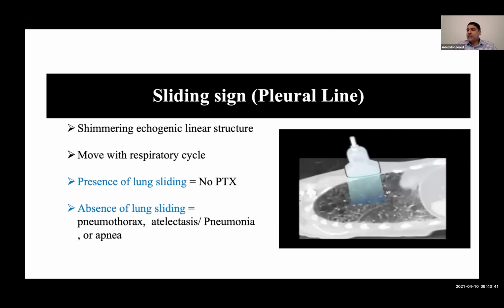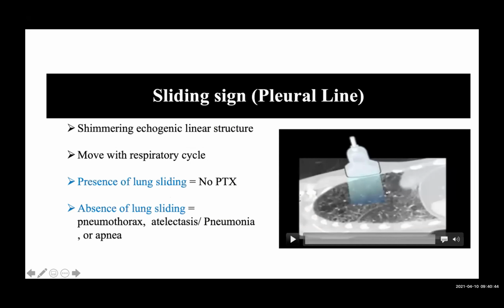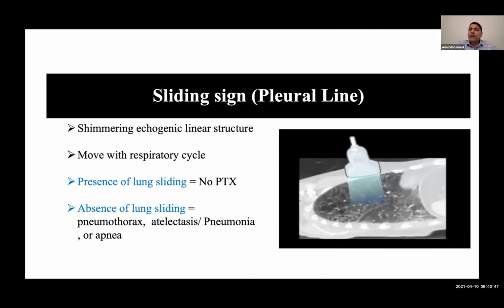What about the pleura itself? As you know, the lung pleura is 2-layered. But there is no ultrasound so far, at least with the one we have here, that can give you the two layers separated from each other and sliding in opposite directions. However, what we will see is both layers as if they are combined and give you one echogenic bright line, especially if the lung is well aerated, that's sliding from side to side, as you can see again in this demo.